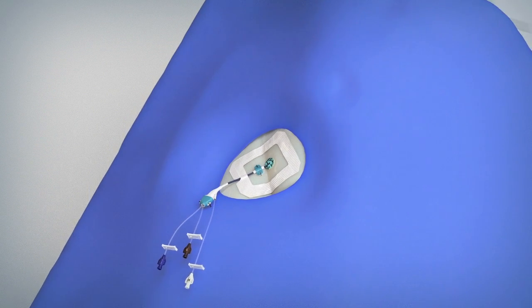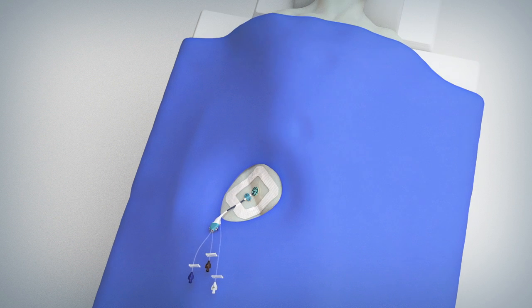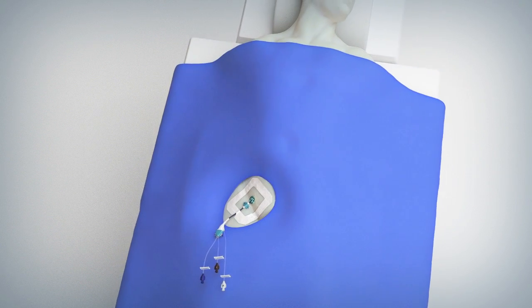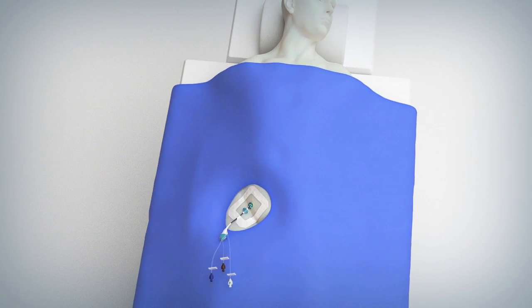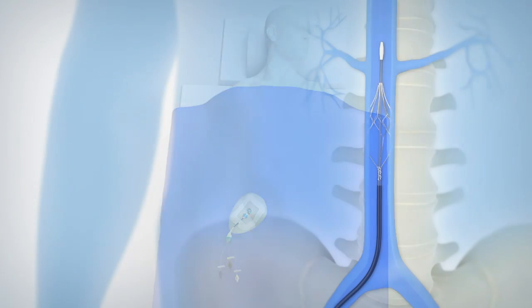The Angel Catheter is now in place, providing access to the central venous system and prophylactic PE protection for the patient. Maintain the Angel Catheter and access site per standard hospital protocols for central line catheters.